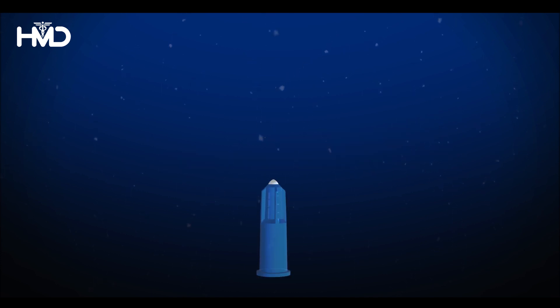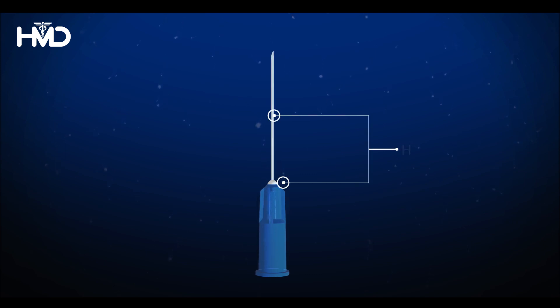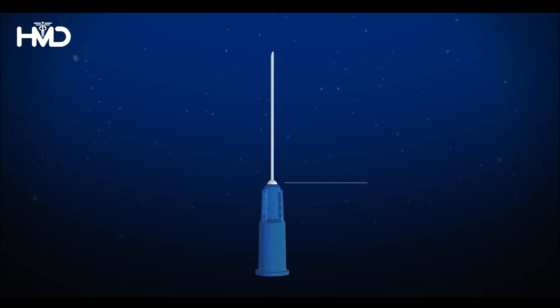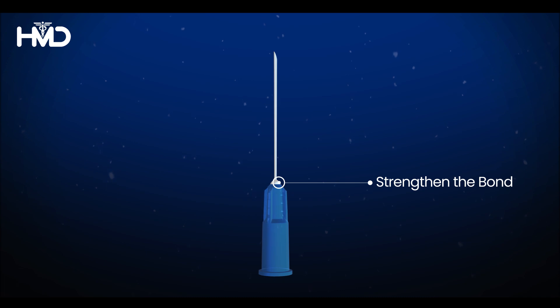Let's see the formation of the product. The hub and cannula are securely connected to assemble the needle. A layer of adhesive is applied to strengthen the bond between the hub and the cannula.